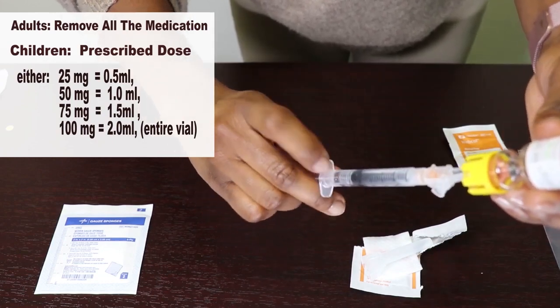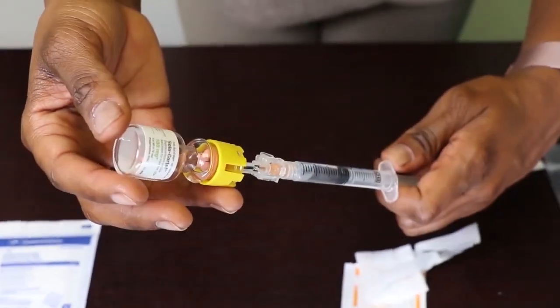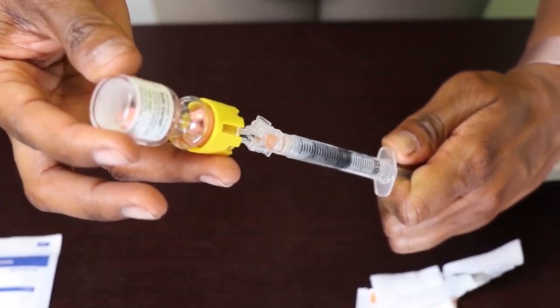As the level of the medication in the vial becomes lower, you may need to gently move the tip of the needle, keeping it below the level of the fluid.